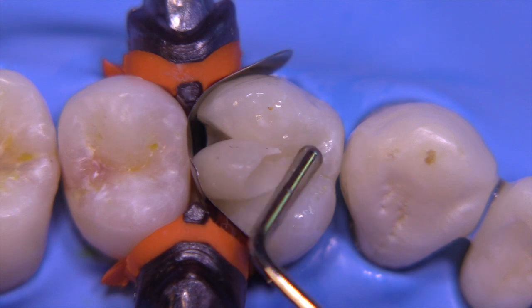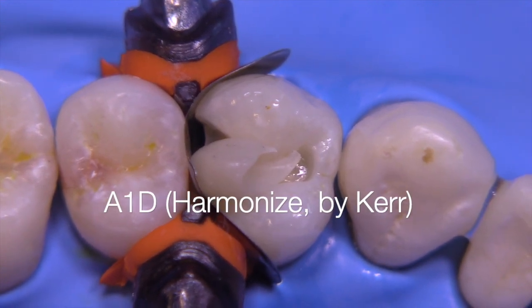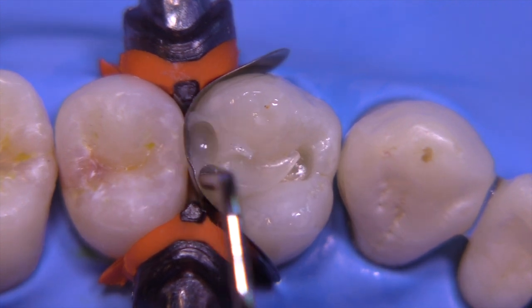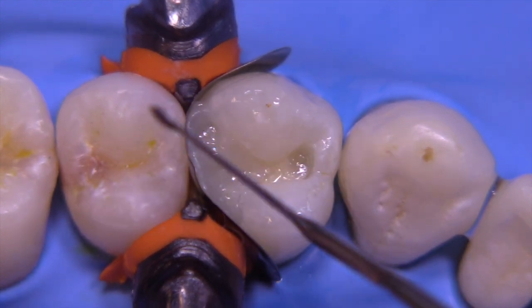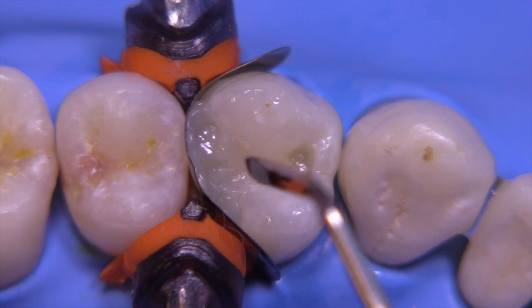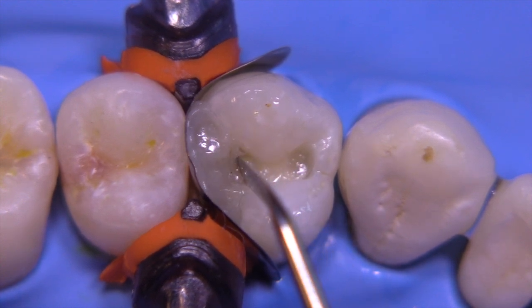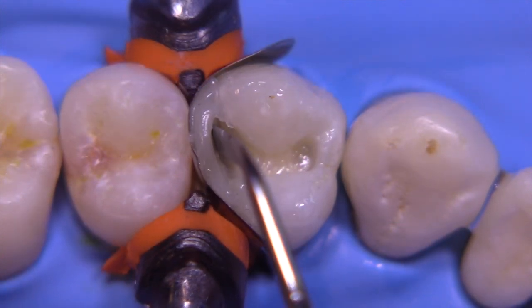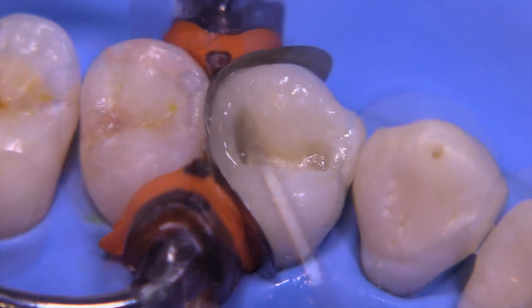After light curing we're ready to build the wall. I'm going to be utilizing a dentin opaque shade, and we're going to condense this into the box, being careful to condense into the corners. Once the box is filled to the level of the cusp tip, I'm going to utilize an interproximal carver — a very thin instrument — and push the material up towards the band, which will cause it to rise up and create the marginal ridge contours we're looking to achieve.